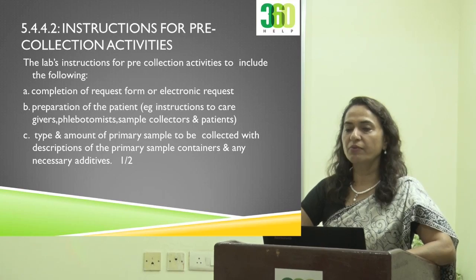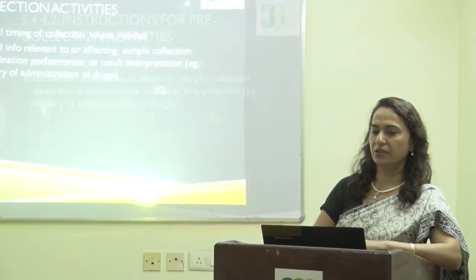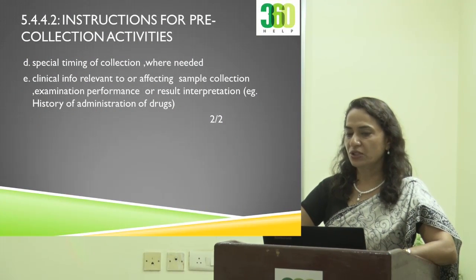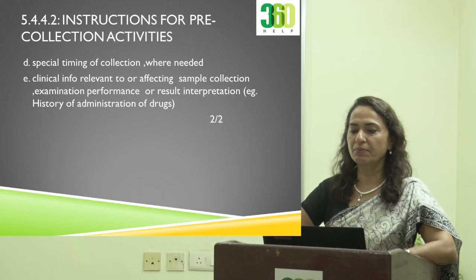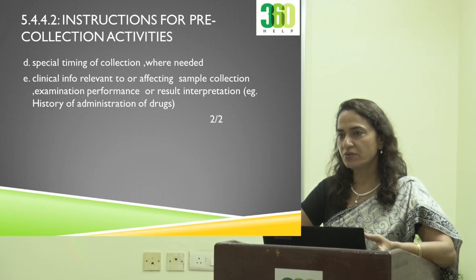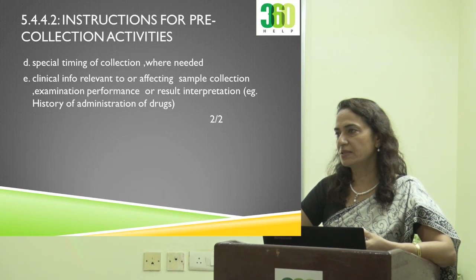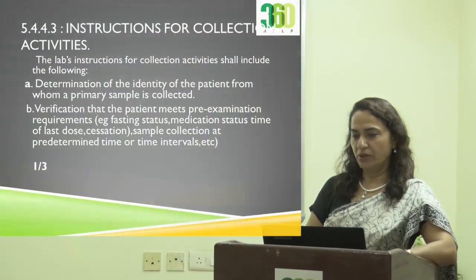Type and amount of primary sample, how he has to collect, in which vacutainer he has to collect, timings of collection, clinical information relevant to or affecting sample collection and examination performance, as we just talked about, any drug history, any antibiotics he has taken. All those histories are important.